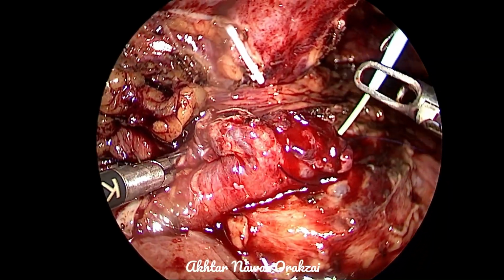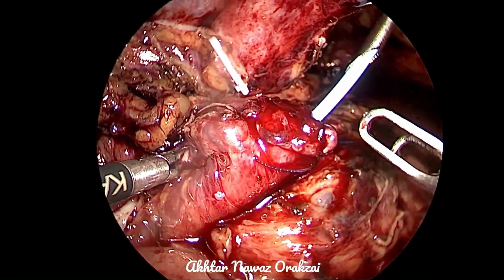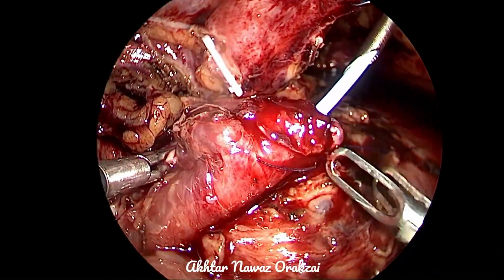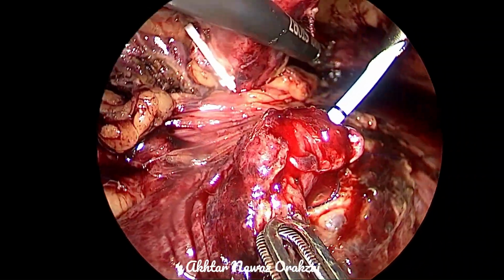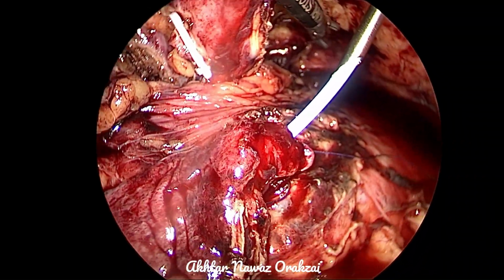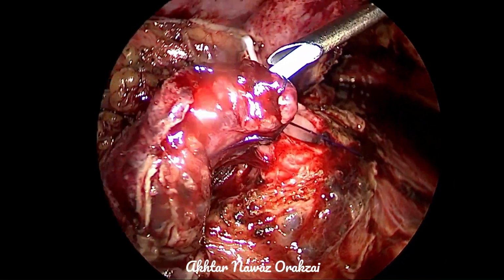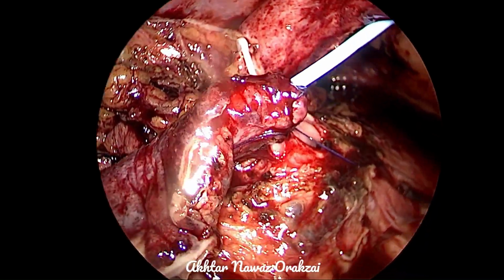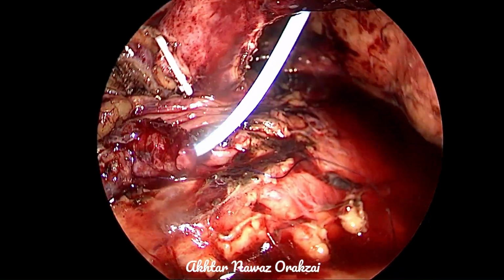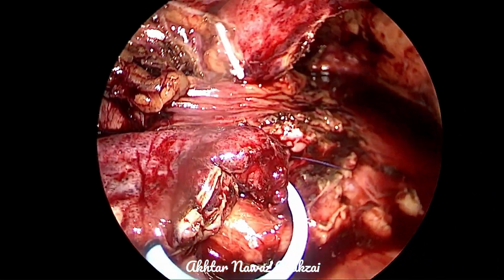It is extremely difficult to stent this grossly dilated tortuous ureter. It is okay if the stent does not reach the pelvicalyceal system. We just need to bridge this anastomosis. However, the port is placed in line with the ureter.